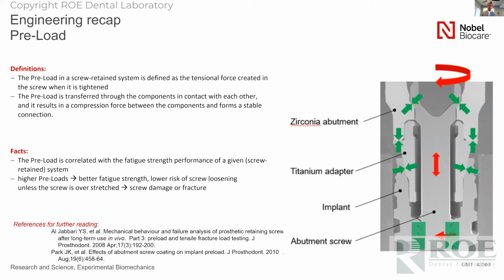And we're looking at better ways that we can apply that torque in as many areas, because as we know, if we over torque in some areas, that can create stress not only on the prosthesis, but also the implant themselves.